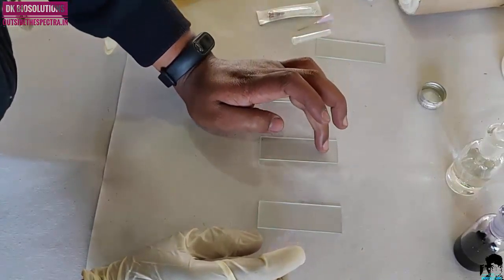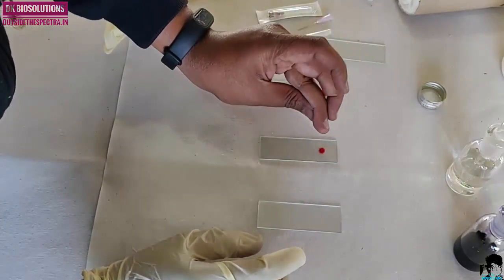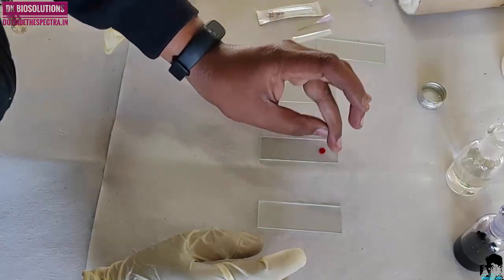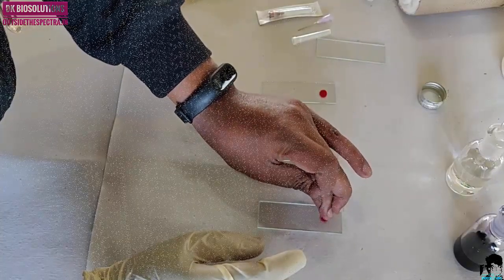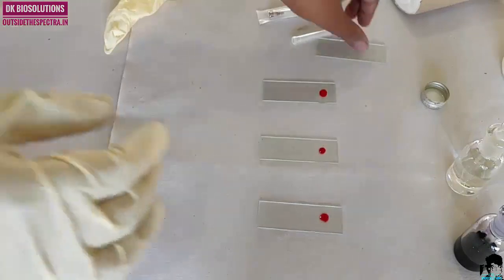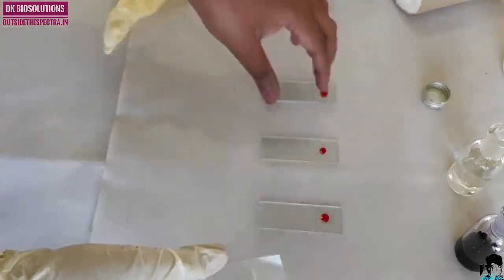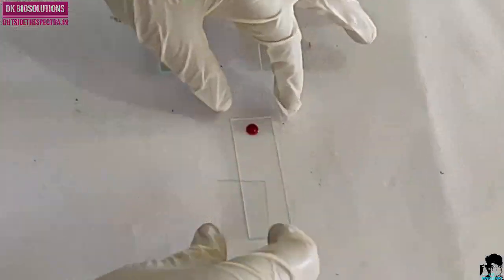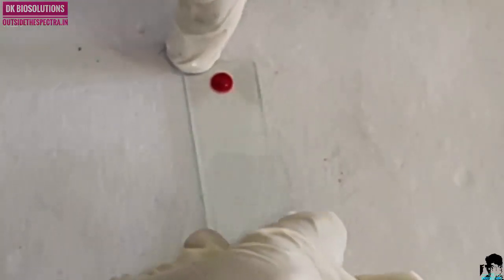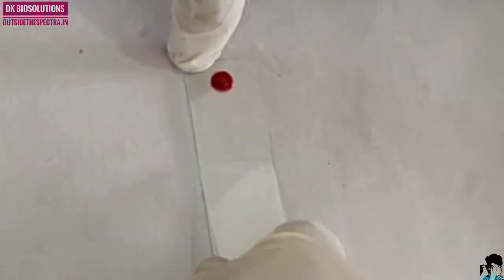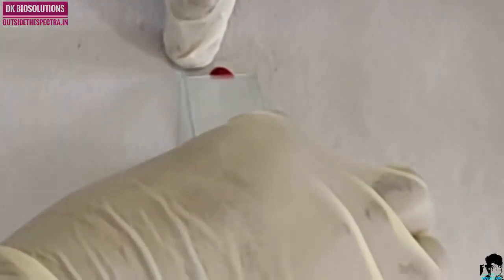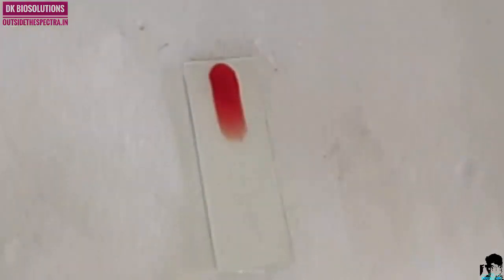We will start with our blood film preparation. Place a drop of blood at one end of the clean slide. After placing a drop of blood at one end of the slide, now use another slide as a spreader to spread that blood into a thin smear.